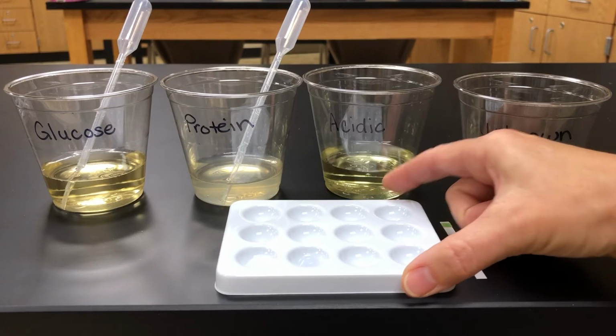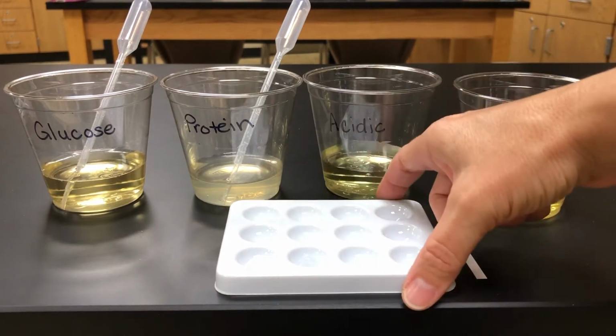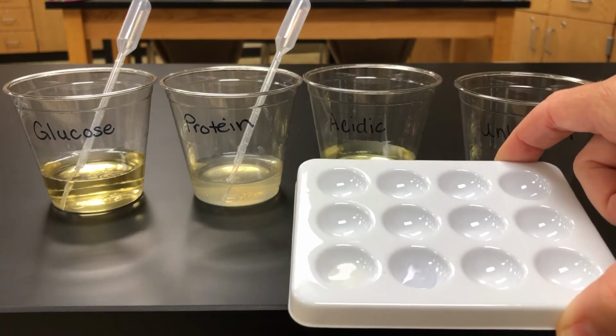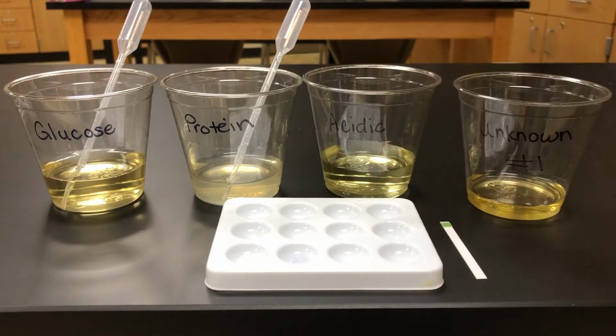Okay, now the thing here is that if we see the solution turn like a grayish purple, that means that protein is present. And if we don't, if the color just stays urine color, then there is no protein present. I don't know if you guys can see that. I don't want to spill it, but it definitely is a kind of grayish, purplish tint to it. Okay, so you guys can go ahead and record your results in the table.